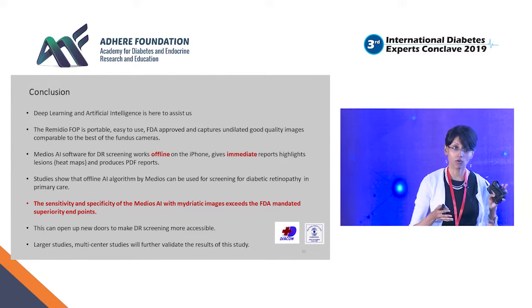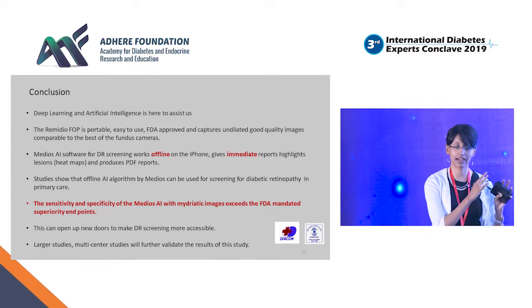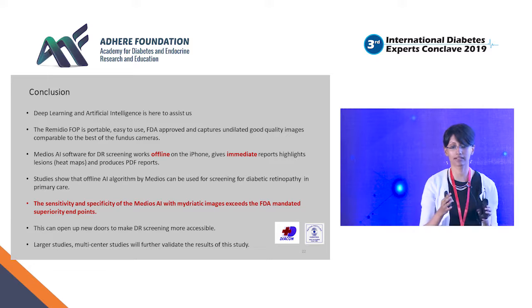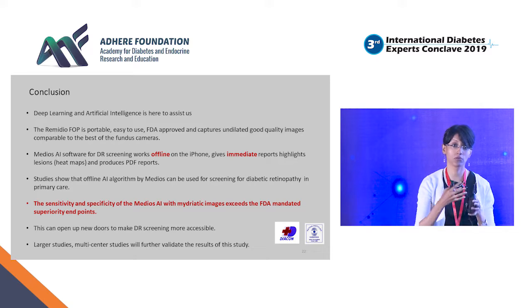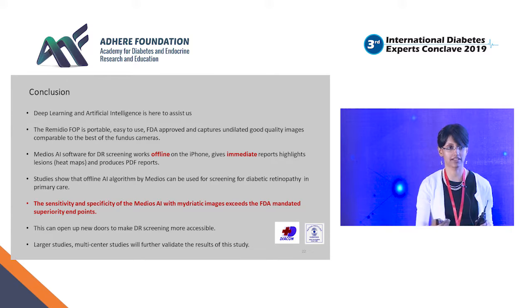And I would also like to point out that the results here, the sensitivity and the specificities that I mentioned from the different studies, are higher than the FDA mandated cutoff, which is 85%. All of these were above 95%. So once it goes through the regulations and so on, it will be easier to get into use in other countries in the world. And this can open up markets for DR screening, as this is accessible and cost effective.